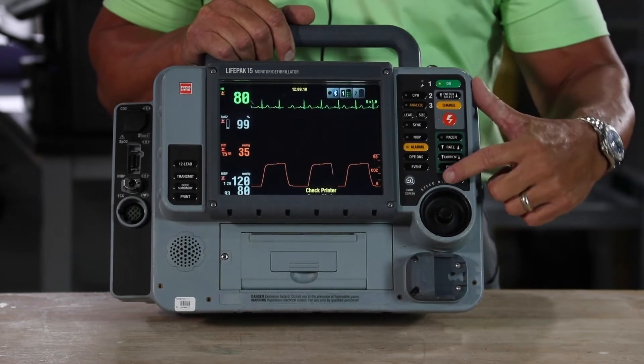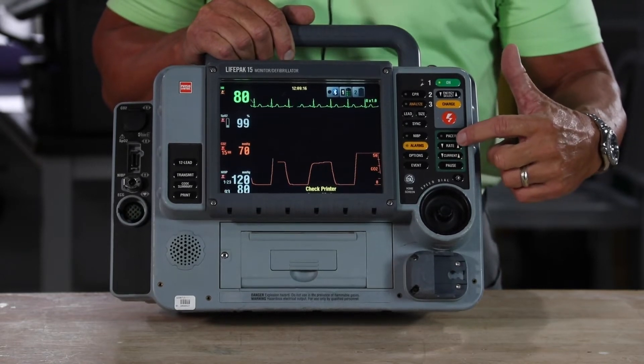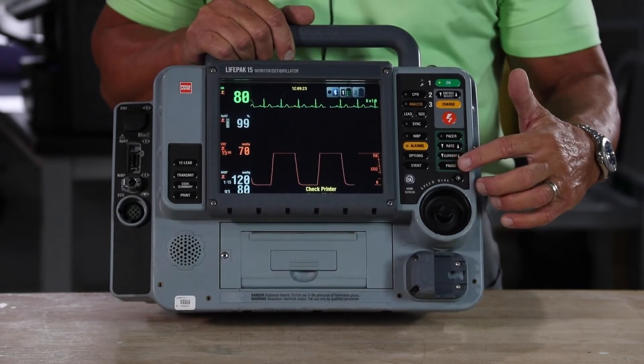With pacing, everything with a green background is pacing, and everything in pacing is listed in the order in which you'd use each feature. So turn the pacer on, select your rate, and increase your current until you have mechanical capture.